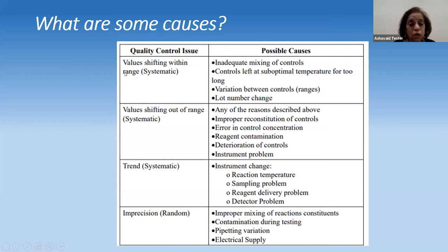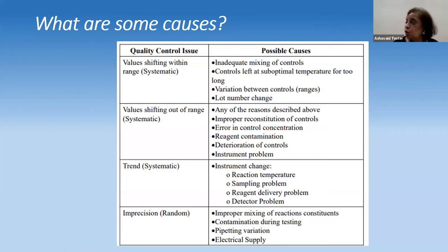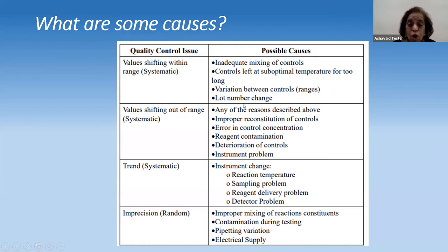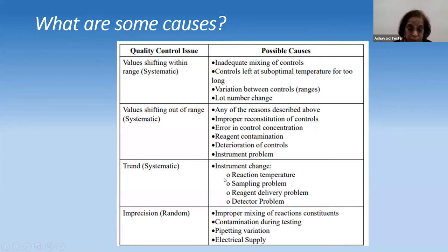There are quality control issues to consider. Value shifting within range is a systematic error — it could be due to inadequate mixing of controls or controls left at suboptimal temperature too long. If values are out of range, it is again a systematic error. If there is a trend, it could be an instrument change — look at reaction temperature, sampling problems, reagent delivery problems, and similar factors.